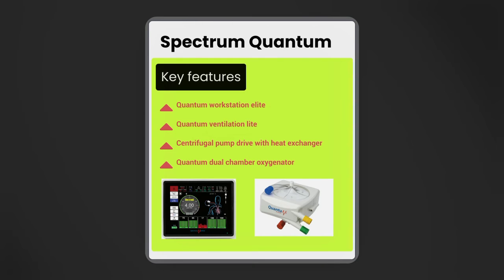That's why if you look at the oxygenator, they have two chambers and two gas inlets. One is supplied with 100% oxygen, and the other one is completely plugged. When blood mixes, it creates a hypobaric condition, and because it's 100% oxygen, it helps to push out all the nitrogen into dissolving into the blood phase. Again, this has to be a clinical decision to see if the benefits of hypobaric ventilation outweighs creating the VA shunt and hence reducing oxygen delivery to the patient. So when I say VA shunt, there's blood that is oxygenated with 100% oxygen, there's blood that's completely not ventilated, and there's a mix that's created.